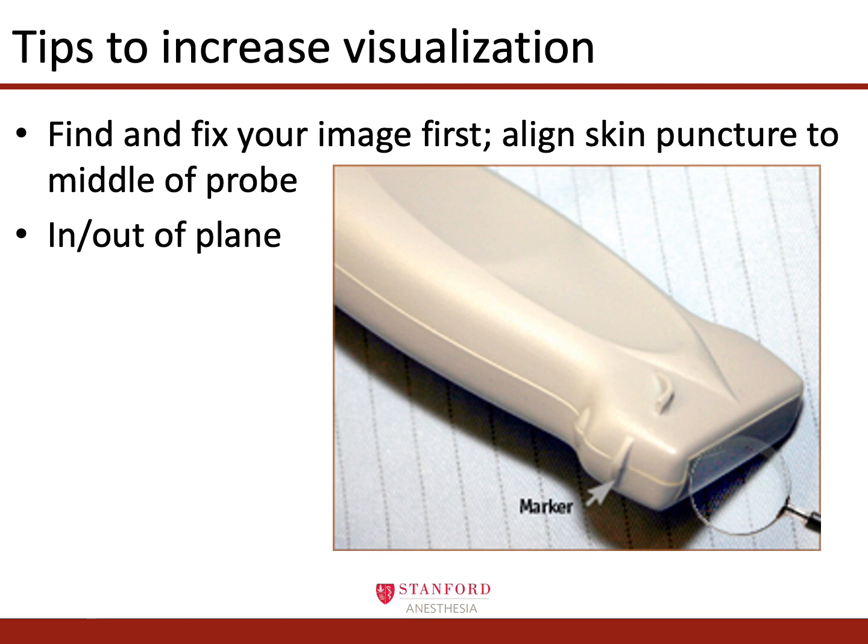However, here, when we're dealing with how to introduce the needle into a fixed image, what we need to do first is to make sure that the probe is anchored, either to the patient with a steady hand or against something. Then we need to introduce the needle into this fixed image, and we can do that by lining up with the markers that are on all ultrasound probes.